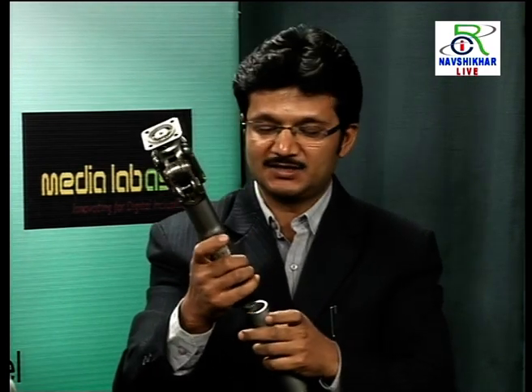So this is the interchangeability of the components. That is the basic idea behind the modular concept. It's a very interesting concept, and a very important thing is that all the parts in this prosthesis are interchangeable, and all the parts are independent of each other; it's not that one part is dependent on another.